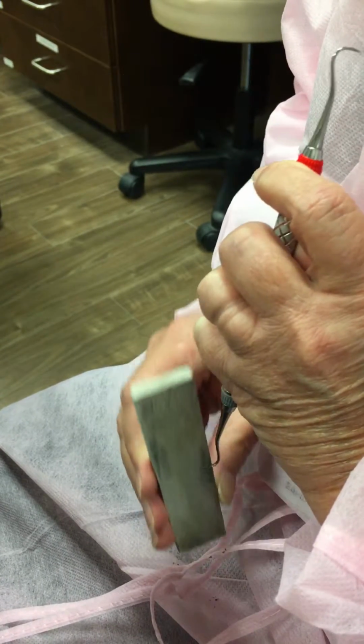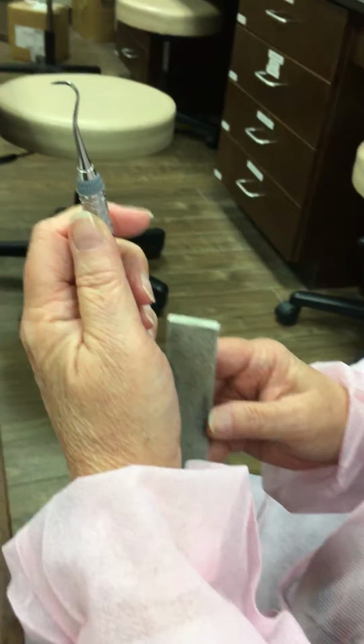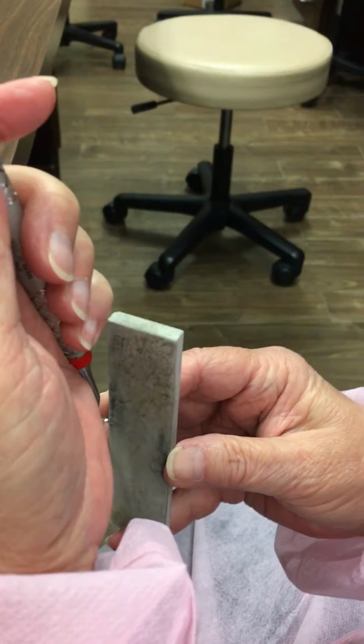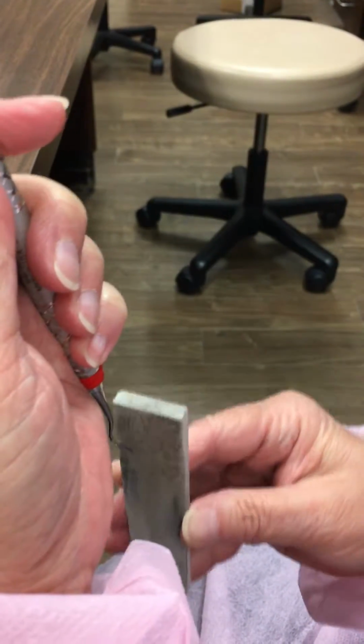Also of note, the instruments were sterilized before I started sharpening them. So I flipped ends, and I'm going to do the other side. I started at 90, then opened to 110.